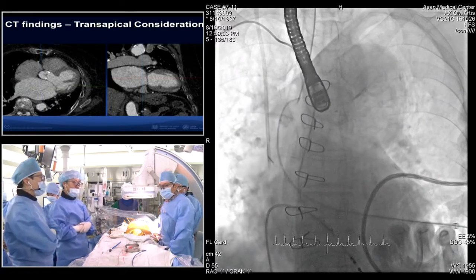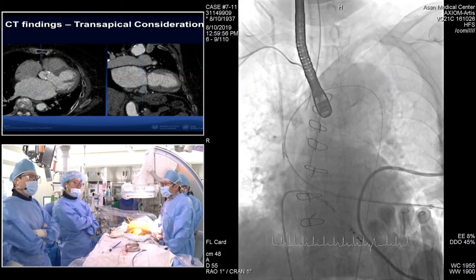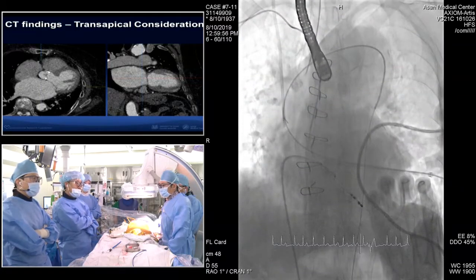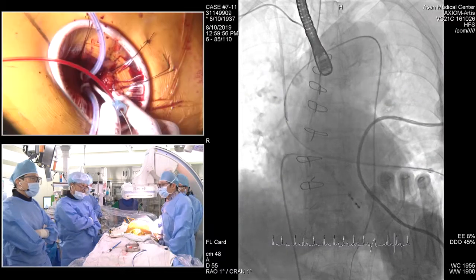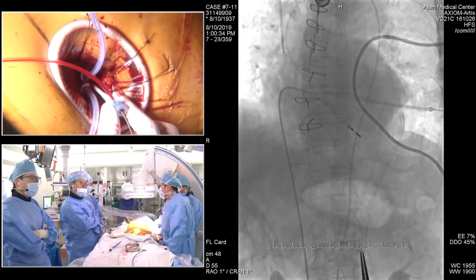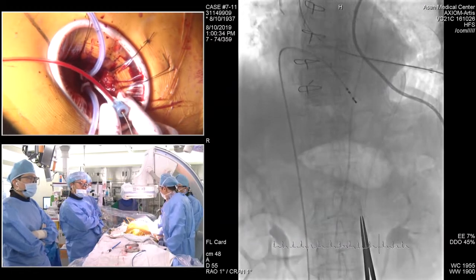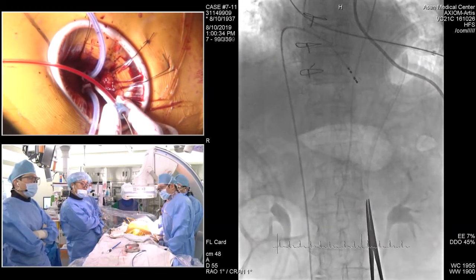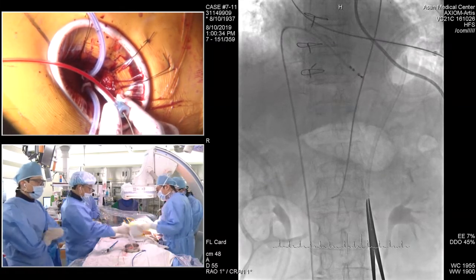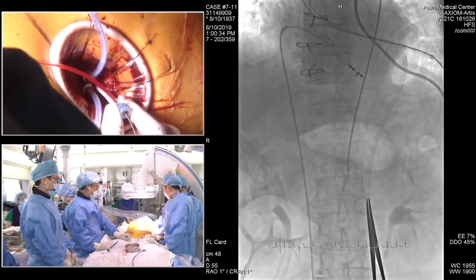I think the main benefit of a carotid approach in this case is the recovery, which with carotid access is very similar to transfemoral. It's a very benign incision, like a carotid endarterectomy incision, but just lower in the neck. Obviously, when you enter the chest, you have chest tubes at the end, and some pain and things like that. But I think you need to be good at one of these, because these cases come up and you need to have a good approach. It's not just about getting through the legs. You could obviously get through the legs here, but the risk of systemic embolization looks very substantial.